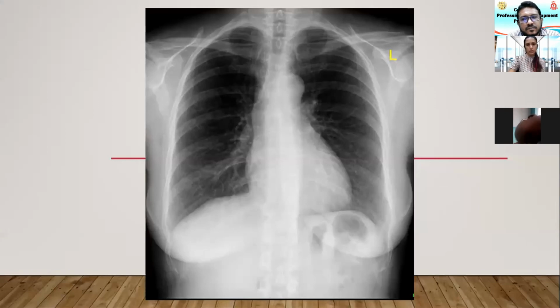How to check for penetration and exposure in chest X-ray? Yeah, that's a good question. I didn't touch on it because of the sake of time. For exposure, in the lower chest X-ray you should be able to visualize the lower vertebra faintly, not very prominent. And you have to see the pulmonary vasculature up to the middle third of the lung without any pathology.